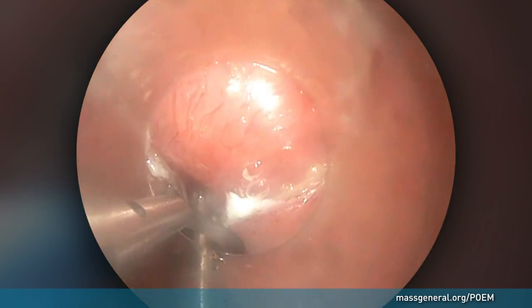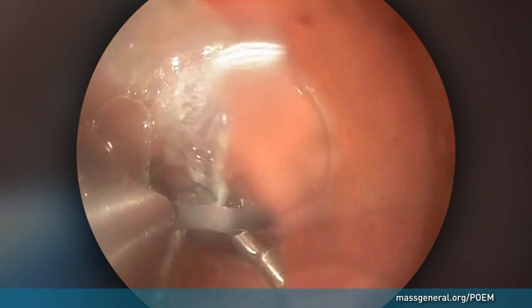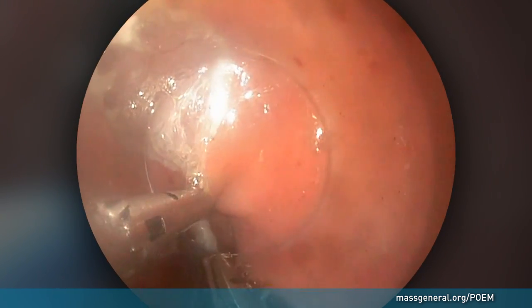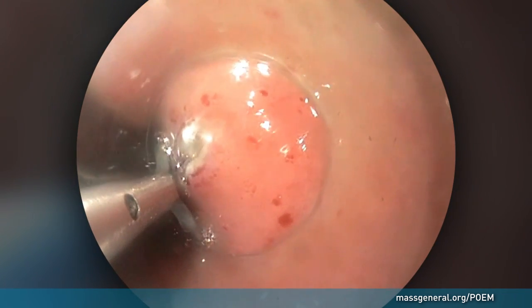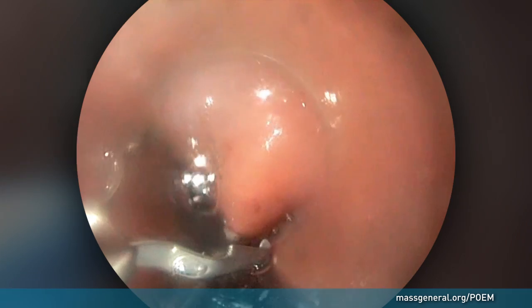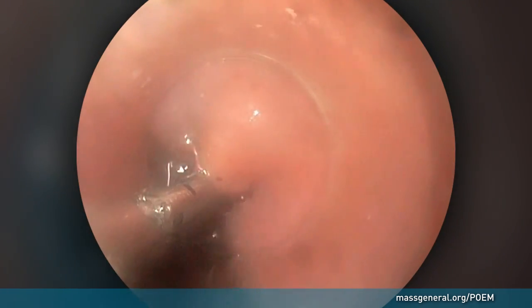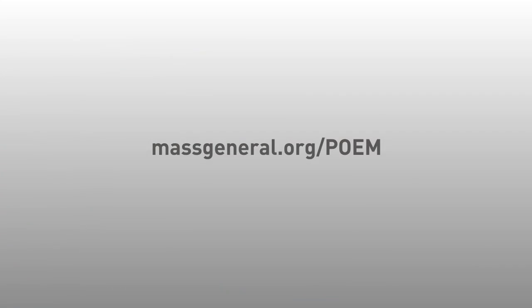These clips fall off after healing and are easily passed through the gastrointestinal tract. Following the procedure, the patient is awakened and begins oral intake of liquids the next morning. Most patients receive complete relief from swallowing difficulties and may return to regular activity in about a week. For more information on the POEM procedure, visit massgeneral.org/POEM.